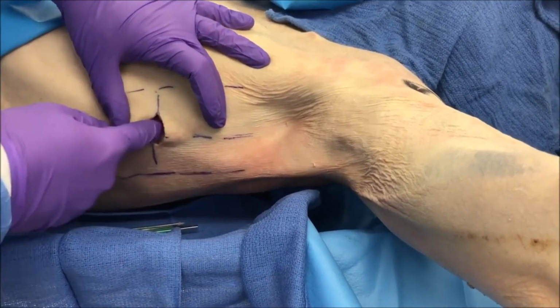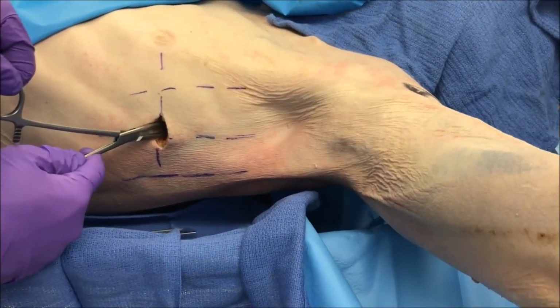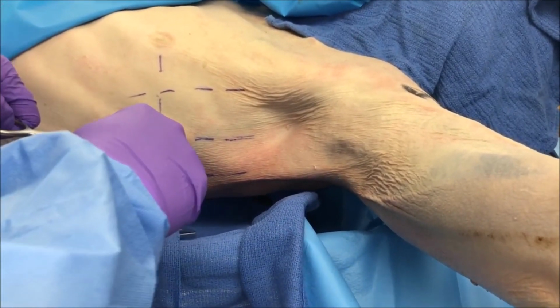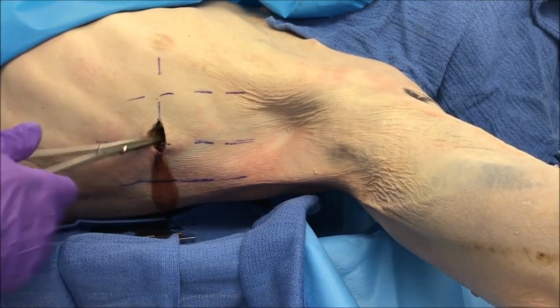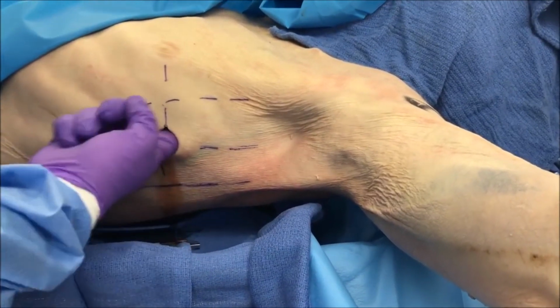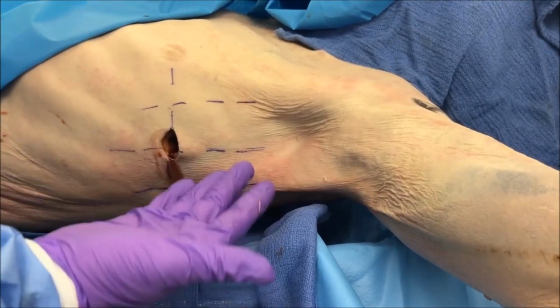You will see it pop through and feel it pop. At that point, we spread the forceps open to open up the chest wall, and you'll see some blood or some air rush out at that time. The finger with double gloves is then placed into the hole and moved back and forth to assure that the hole is open.